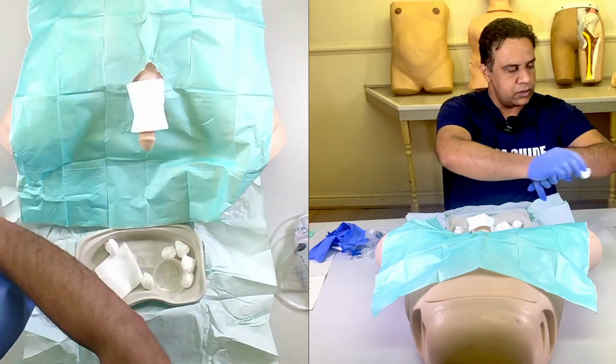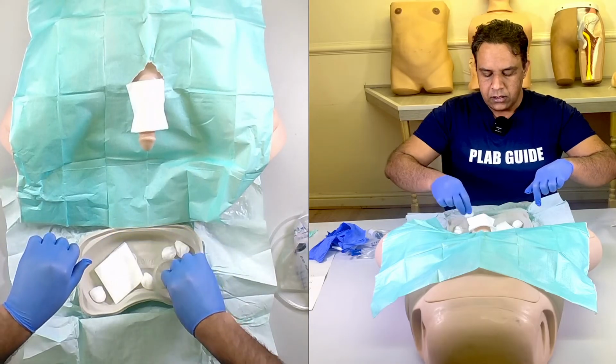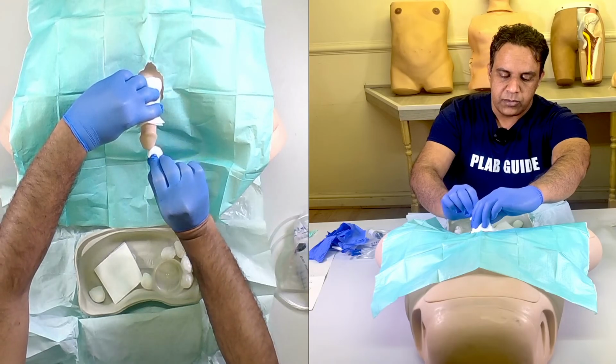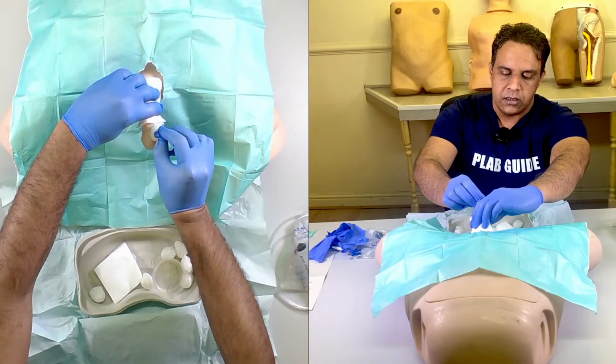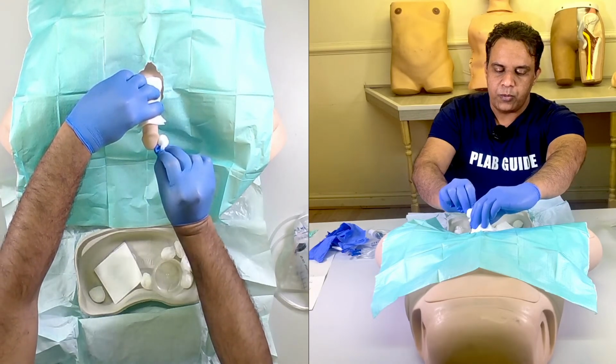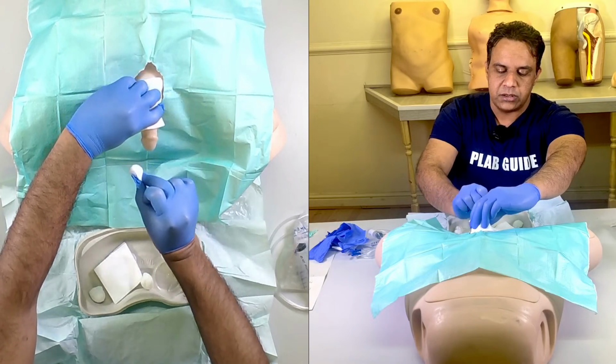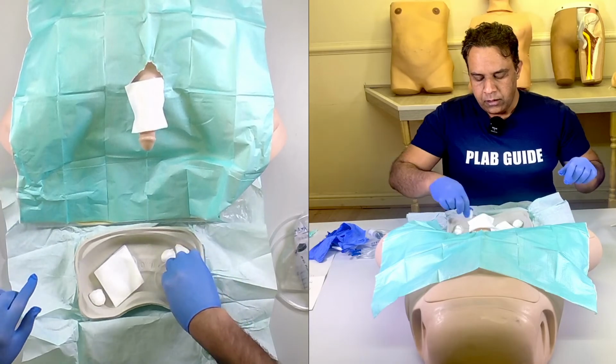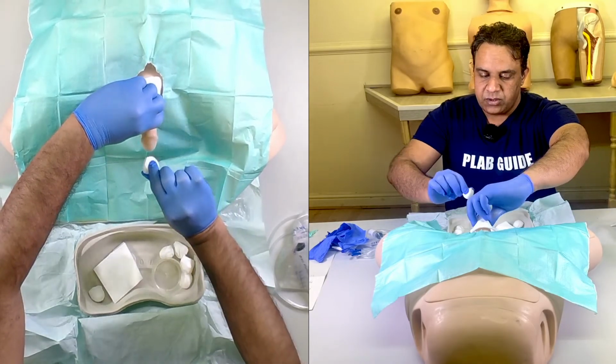This goes in the clinical waste. Clean it again, moving away from the meatus, and clean it properly. At no point should you be touching the penis directly without holding the gauze in the middle. Clean it at least 3 times.